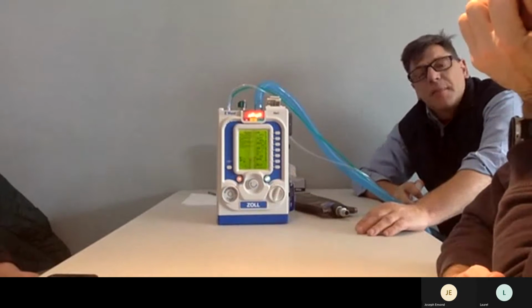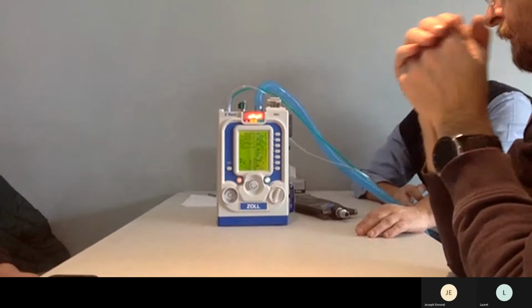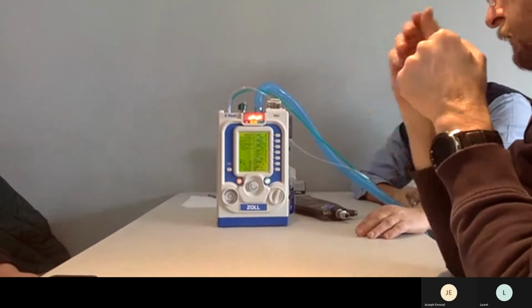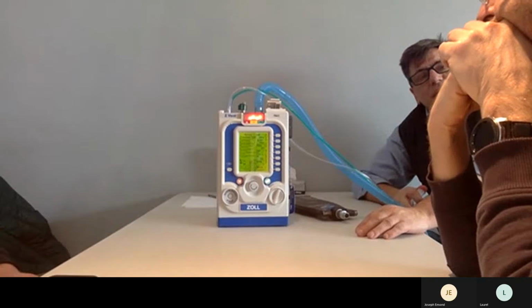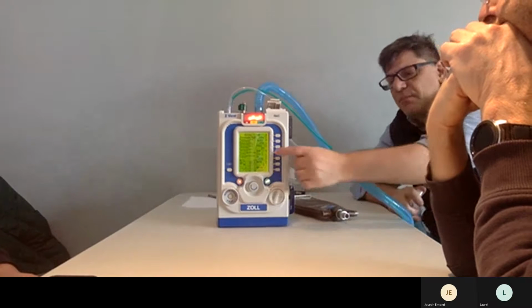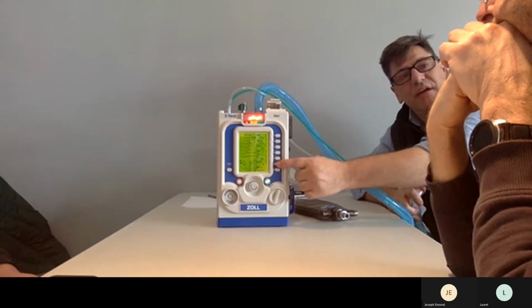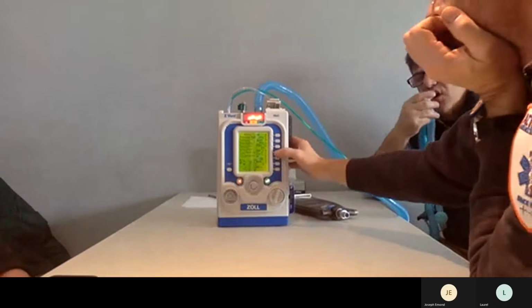What is trigger? Trigger is the amount of pressure drawn to trigger the vent to breathe. And what's our factory preset? -2. And what's the hard-to-pull, heavy trigger? -6. What's the easy-to-pull trigger? -0.5. Thank you. So PIP and PEEP are on the same line. Can you see that?